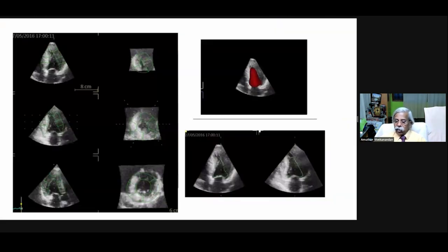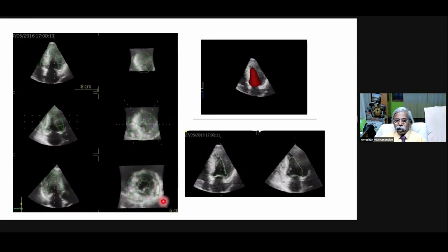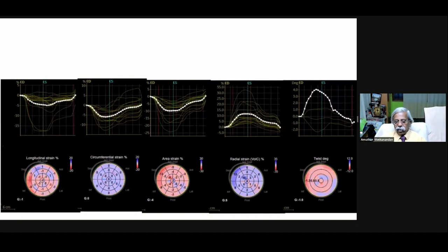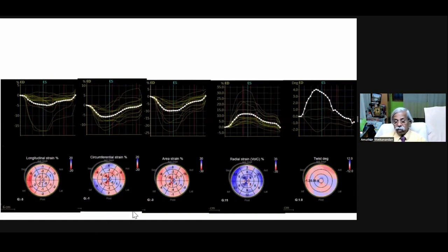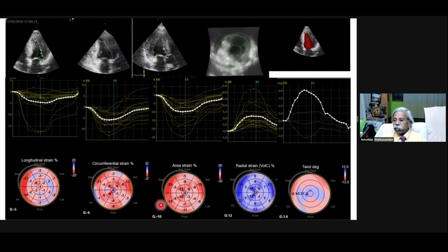In a patient with hypertrophic cardiomyopathy, you see septal hypertrophy and apical hypertrophy more than at the base. Left ventricular 3D strain is affected in areas of hypertrophy — the septum and the apex — where strain is reduced. You can freeze it in end-systole and see the frozen bullseye map rather than the dynamic one.